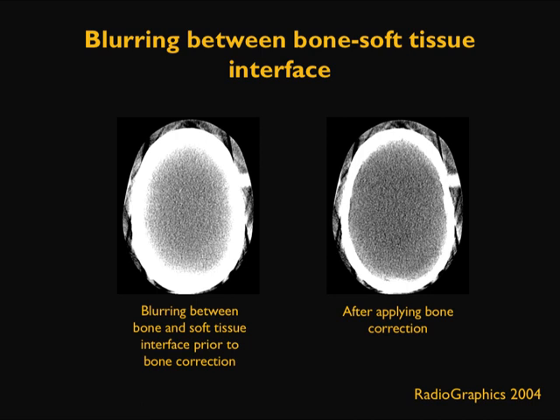Here is an example using a skull phantom. On the left-hand side, due to increased attenuation on the bony surface, there is blurring between the bone and soft tissue interface. This skull phantom consists of two very different attenuation materials. When proper bone correction is applied, you can see the images after correction, which eliminates this blurring between the dense bone and soft tissue interface.